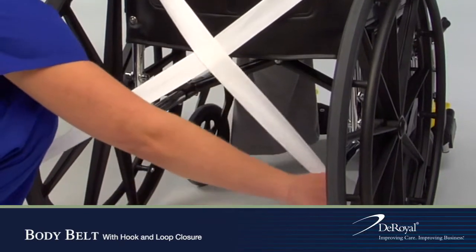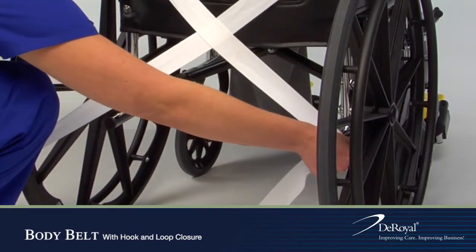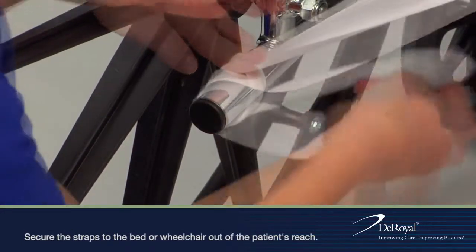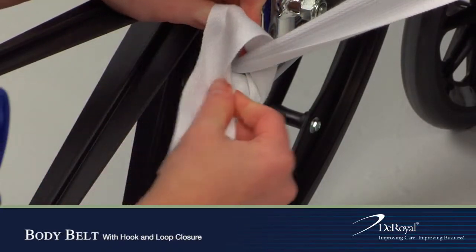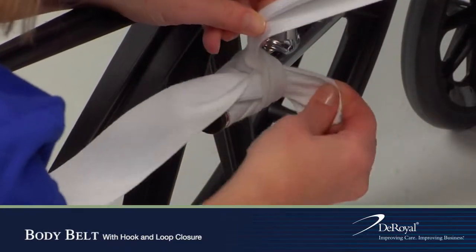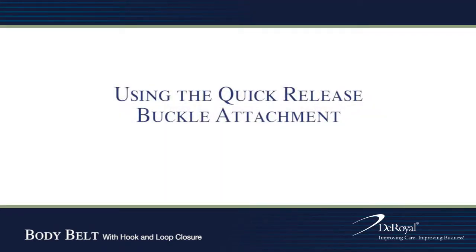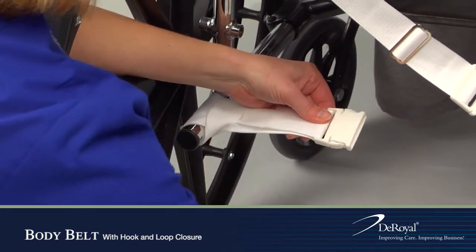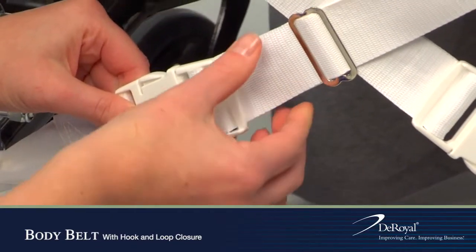Bring behind the wheelchair and cross straps behind the back of the wheelchair to make an X. Secure straps to the wheelchair tilt bars. Secure by connecting the male and female ends of the buckle.